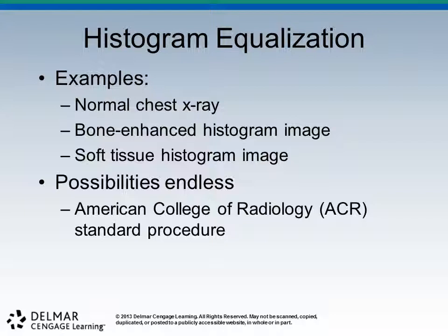Google that. Go to Google Images and search bone window CT head and then soft tissue window CT head. And I will tell you the thing that blows me away is that we can get our contrast or our window so far open that we can see the individual hairs on people's heads. And then we can get it so narrow that all we see is the actual bone itself. And it's all in the same data set. And that's without any additional exposure to the patient. It's pretty amazing.